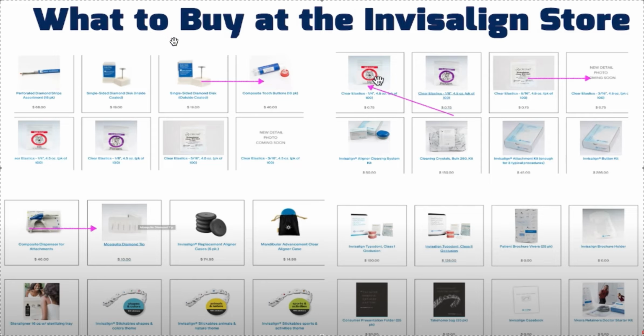IPR stuff, no, I wouldn't. I mean, you can, but I think the best one is the fit strips. You can buy those from Garrison and it's cheaper, way better. And I have how-to videos on how to use them. Certainly not cleaning crystals, just use denture tablets. That's kind of silly. Get them from Costco.